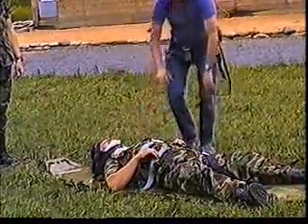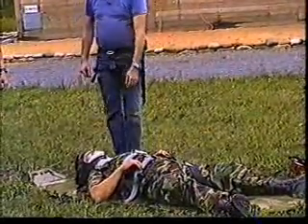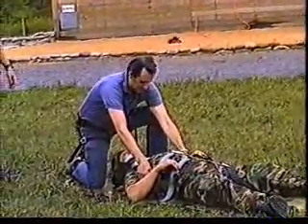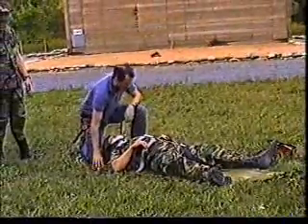Okay, but now we don't have him centered in the stretcher in the right position, but the stretcher is so slippery that it takes very, very little effort to move him. So I can just take the straps below here, pull him up where I want him, make sure he's centered.